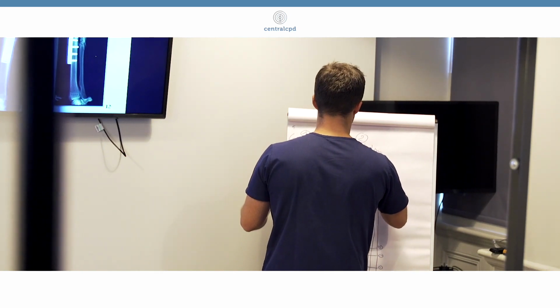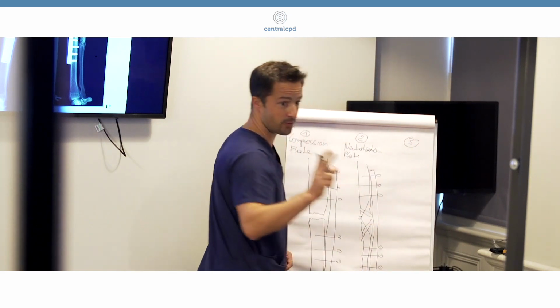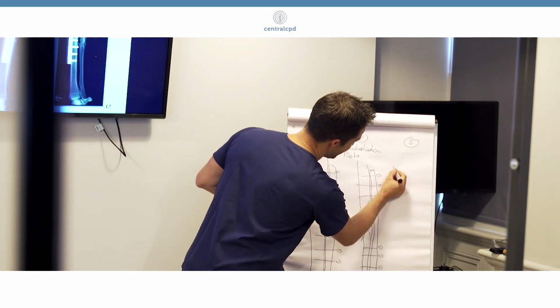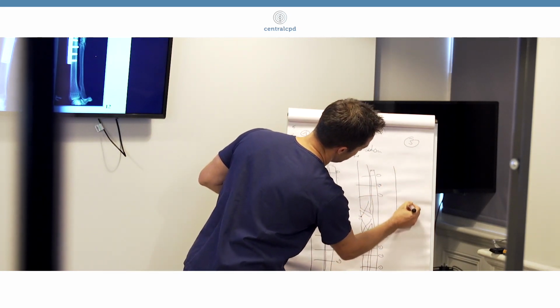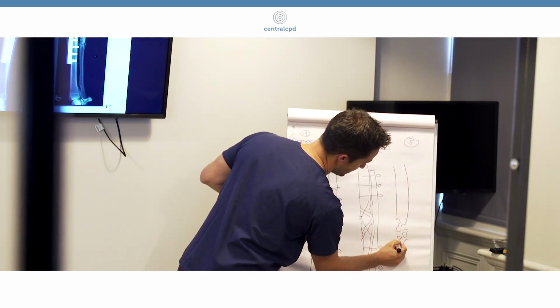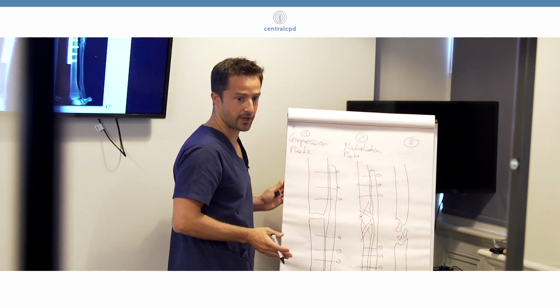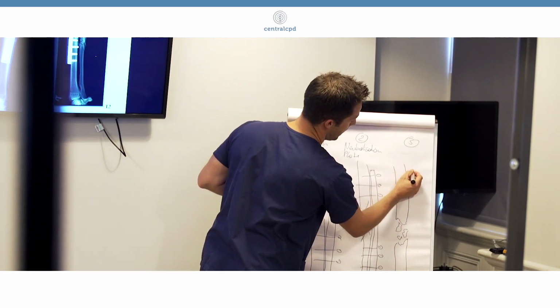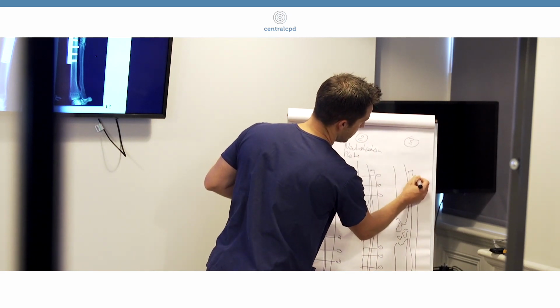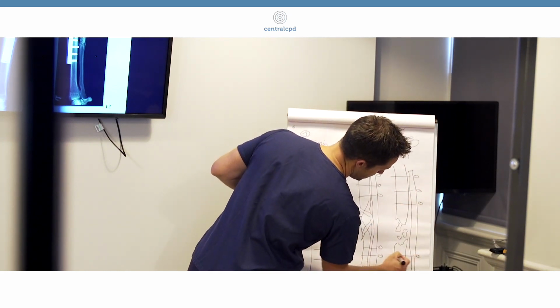And the third thing, it's always three with surgeons because it's easy to remember. Four or five will be difficult. We have a fracture which we cannot reconstruct, which is a comminuted fracture. Anybody has an idea how our reconstruction is called now? Exactly. This is now a bridging plate.